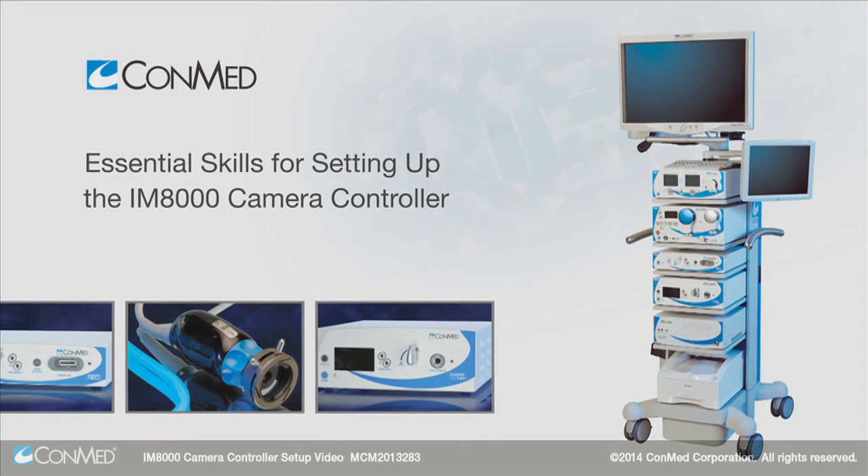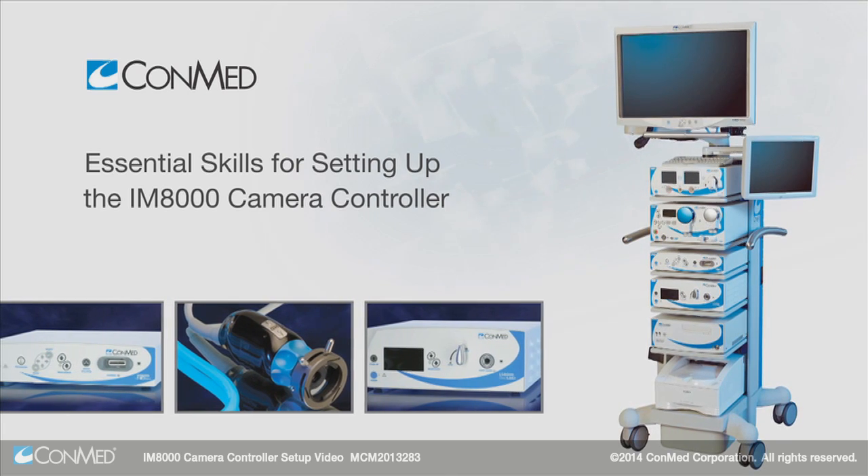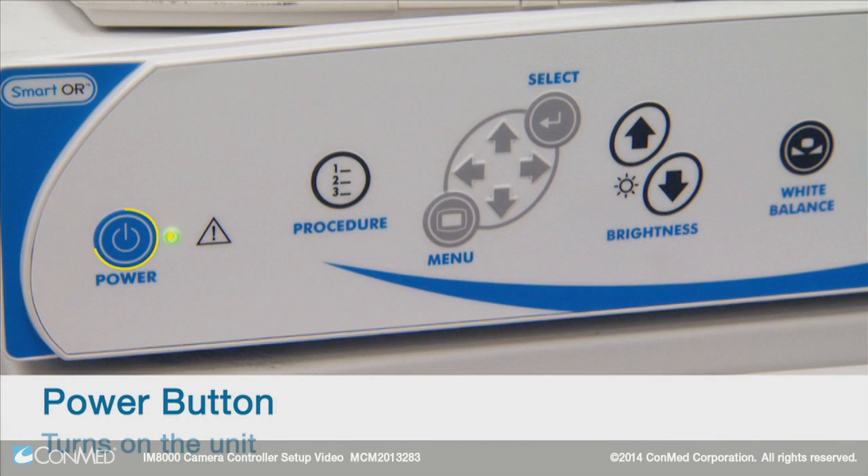This video explores the setup process and menu features of the IM8000 camera controller. On the front of the console, press the power button to turn on the unit.